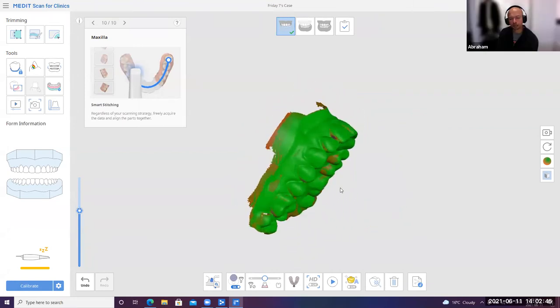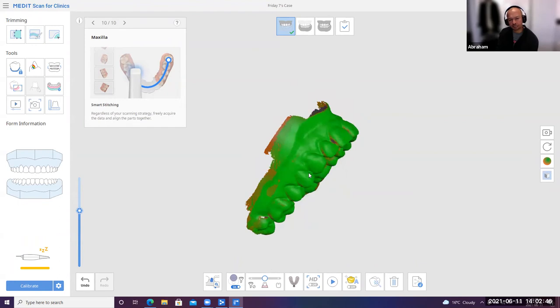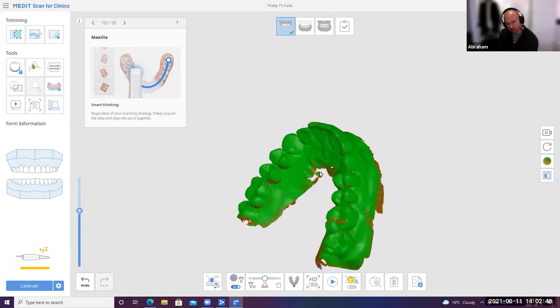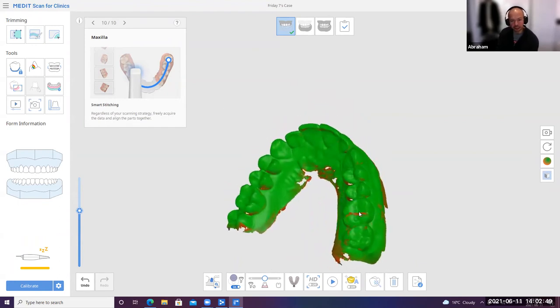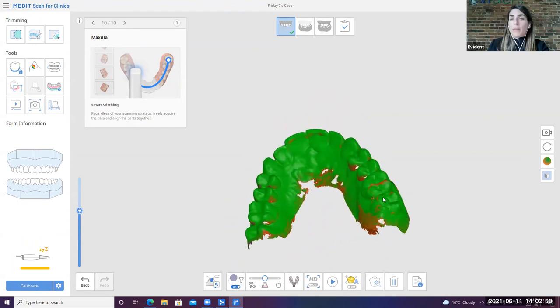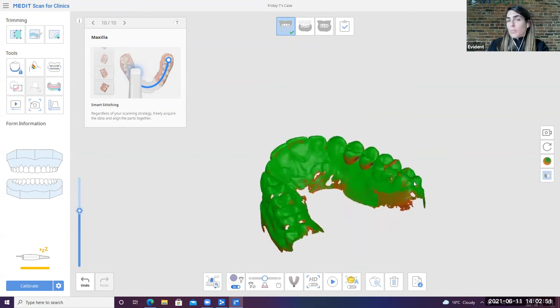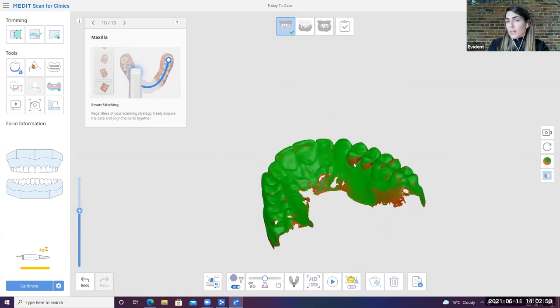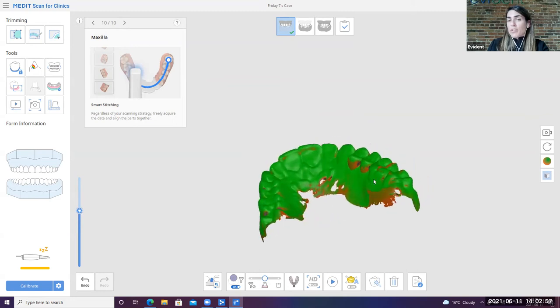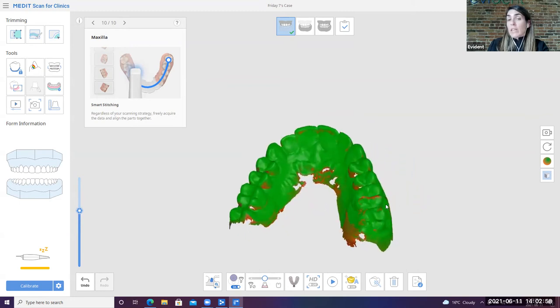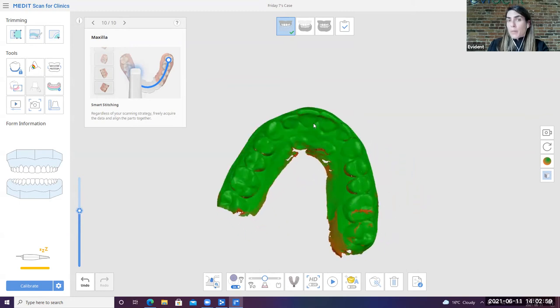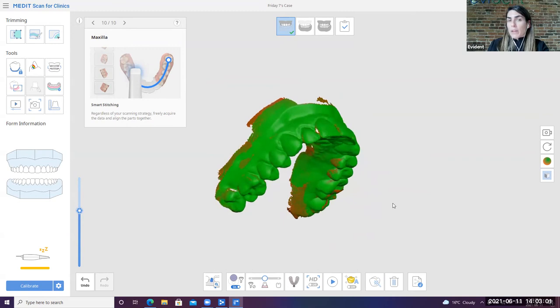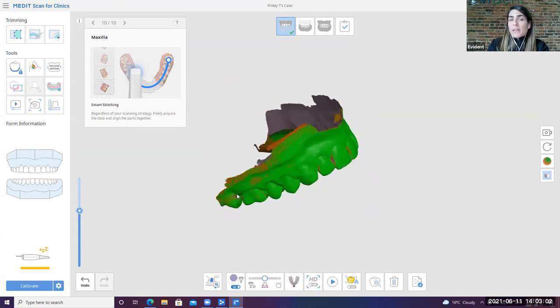Okay. And what does the red mean? So there's like green and red or orange. Yes. So the red means that I do need a little bit more data. So you can see here that this is a bit incomplete. We can see that there's these little holes here that I need to fill. So it's just a very clear color map for me to know where I've got to pick up that extra data.